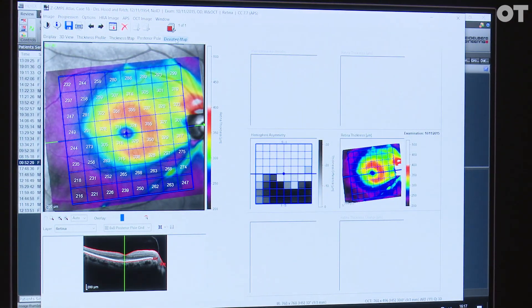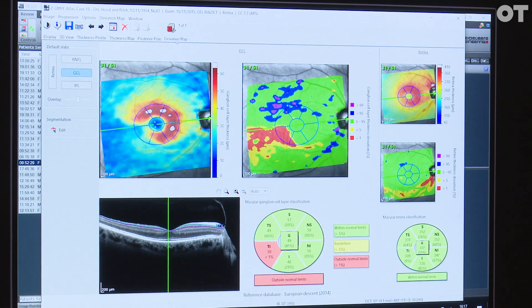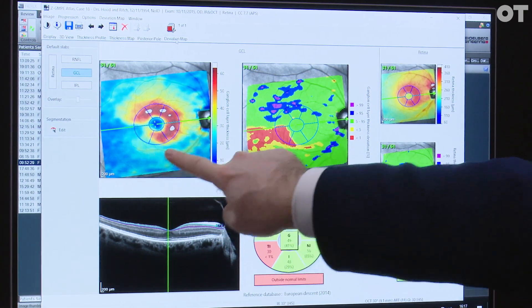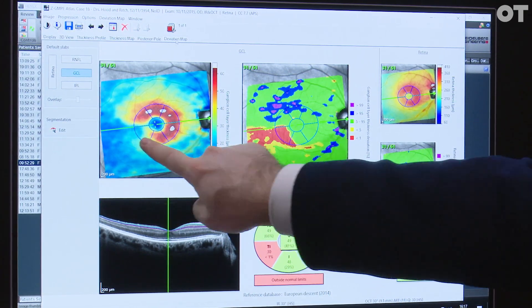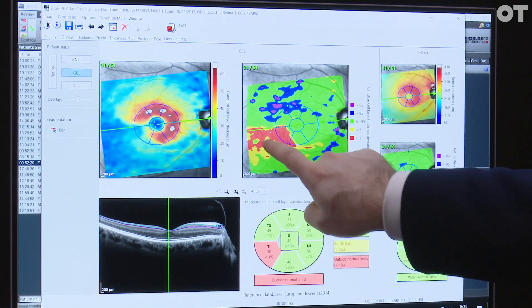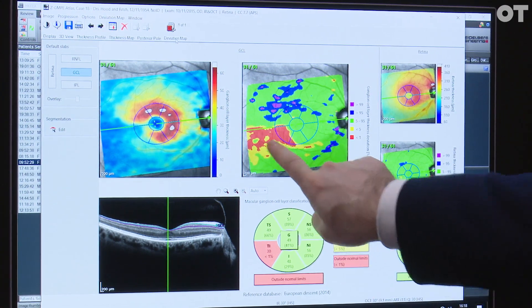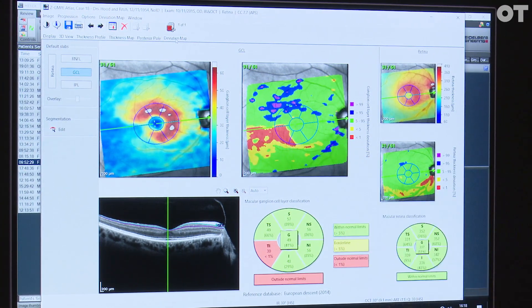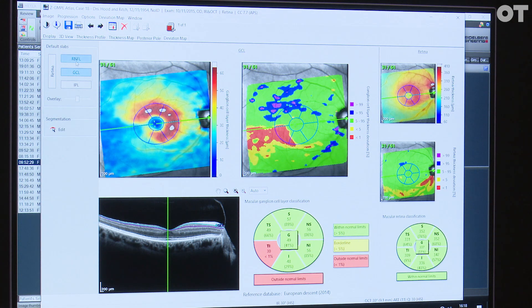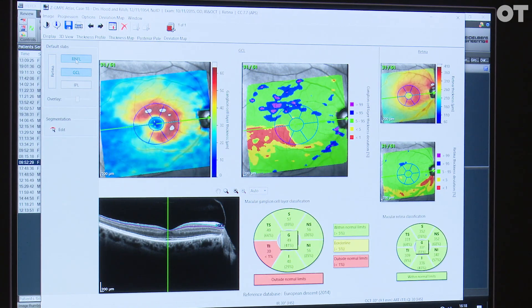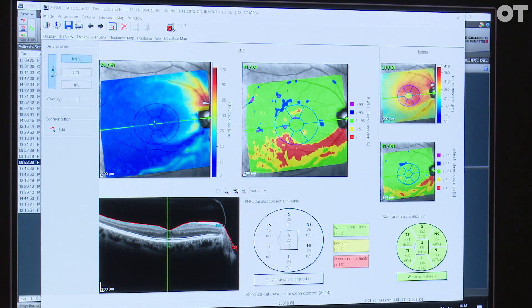What we've introduced this year is something called the deviation map. When I click on this, we're now getting normative data that fills in the gaps — so where you've got loss of structure, you can see that compared to a normative database, red areas appear, telling you this is different from everyone else in the database. This is the bottom one percent of the data. When I move my cursor around, it changes color — that's the ganglion cell layer; this is the retinal nerve fiber layer — showing the full extent of the glaucoma damage.